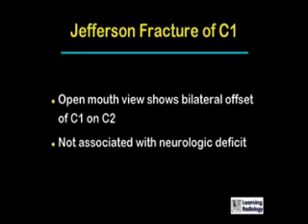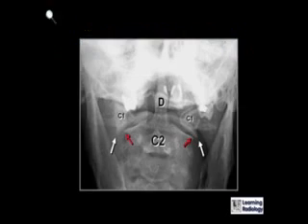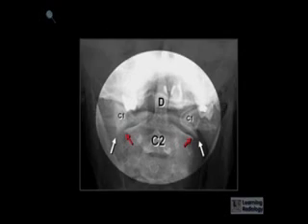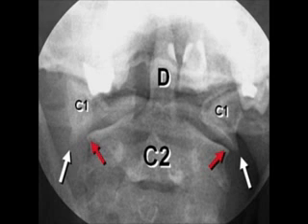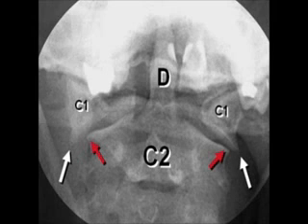Jefferson fractures are usually not associated with neurologic deficits because the body of C1 actually becomes wider and allows for more space for the spinal cord. This is an example of a Jefferson fracture seen on an open mouth view. You can see that the lateral masses of C1, indicated by the two white arrows, clearly lie lateral to the edges of the lateral masses of C2, indicated by the red arrows.